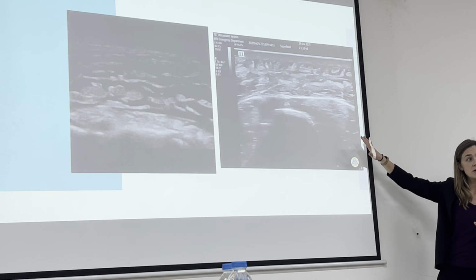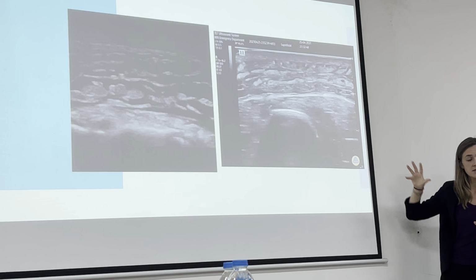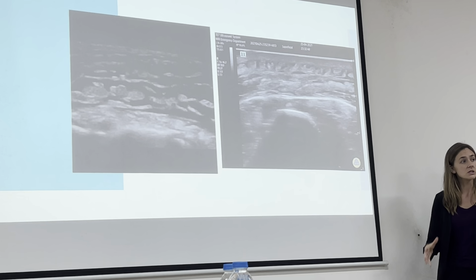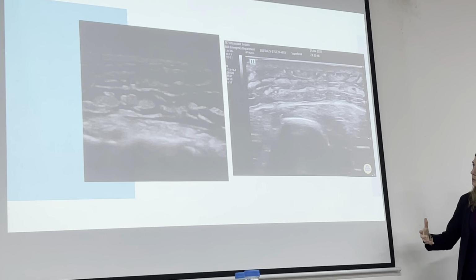However, if you did this to a patient who has a history of CHF, so heart failure, and they have notable edema in both of their legs, you would see something similar, because you are similarly having that extravasation of fluid in the surrounding tissue.